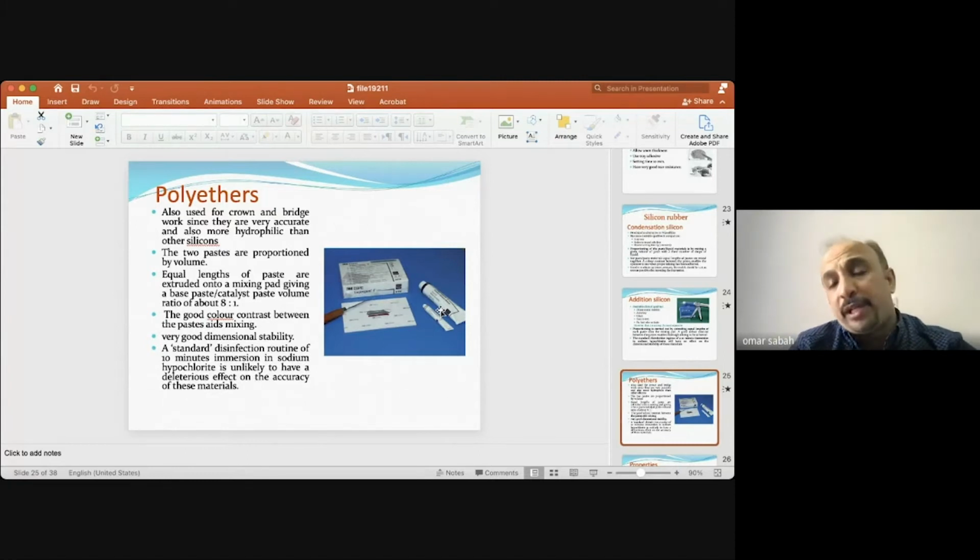The second point, before I start to take the impression, especially with a material that sticks, like zinc oxide eugenol, I put Vaseline on the lips, okay? Take care, because this material will stick to the patient. What I mean is, a patient coming to you may have, for example, sensitive lips, okay? You have some hair. This material will be highly sticky.